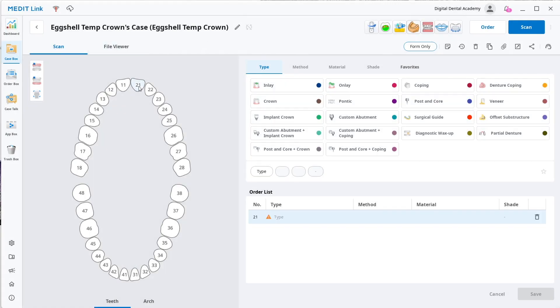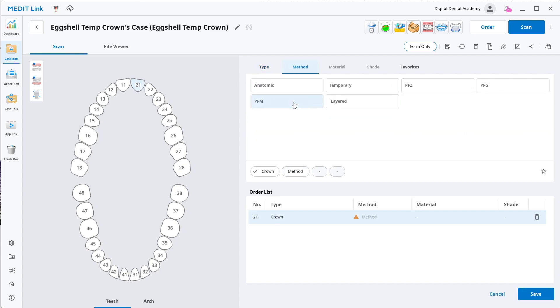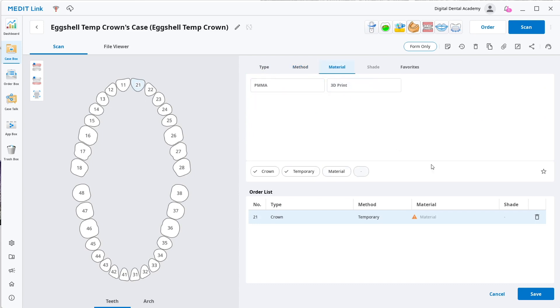Hi everybody. In this tutorial we're going to be showing you how to use Medit's temporary tooth function in their app. For that we have to bring in a case and we have to select what we're going to do with that tooth, otherwise it won't let us.